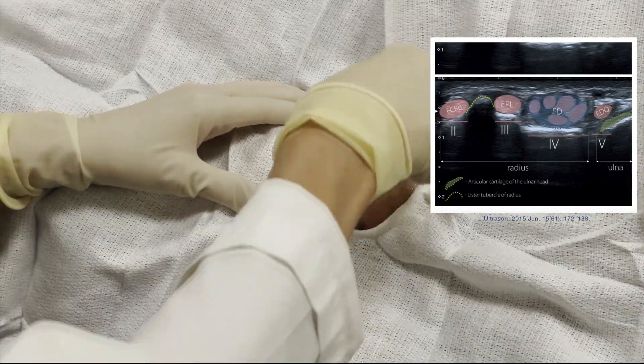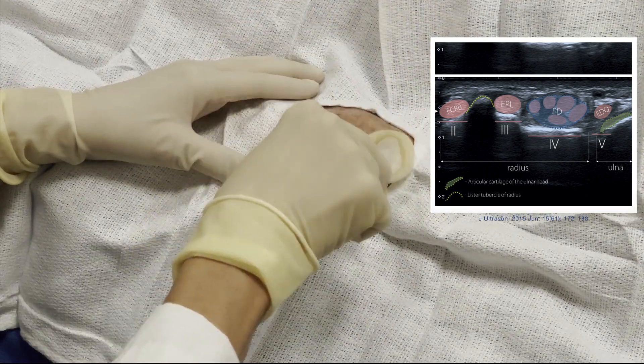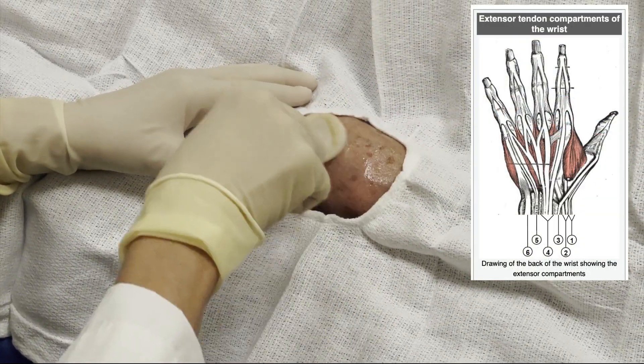Here's a quick tutorial on how to aspirate the wrist from the dorsum compartment four of the wrist. I first use an ultrasound just to get my bearings.